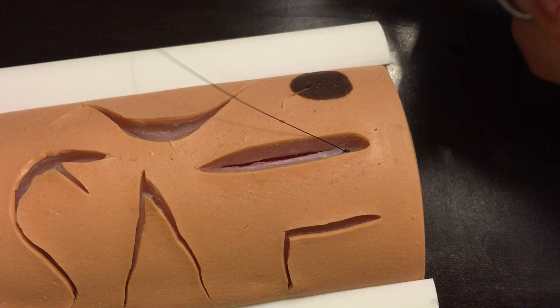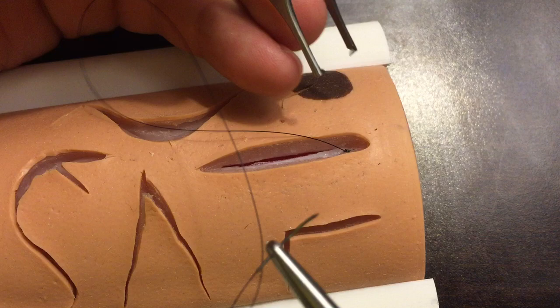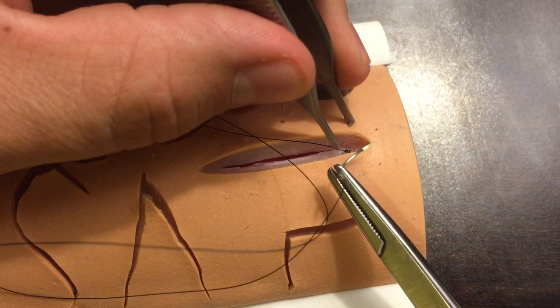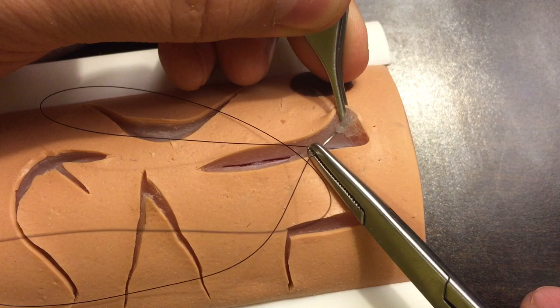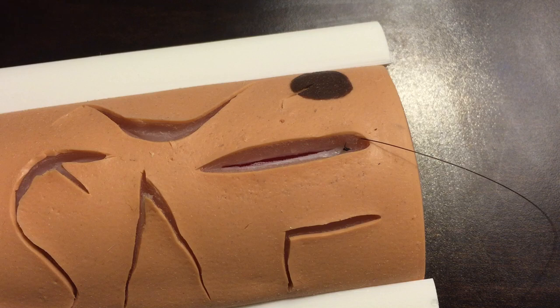Now I'll get my needle loaded back up. On this next pass it's important to load your needle backhanded because we're going to try to get back near the apex just underneath the epidermis. Since my anchor is on my side, my next suture is going to be on the opposite side, so I reach across and come up out of this tissue just under the epidermis — see where that came through — and pull that across.